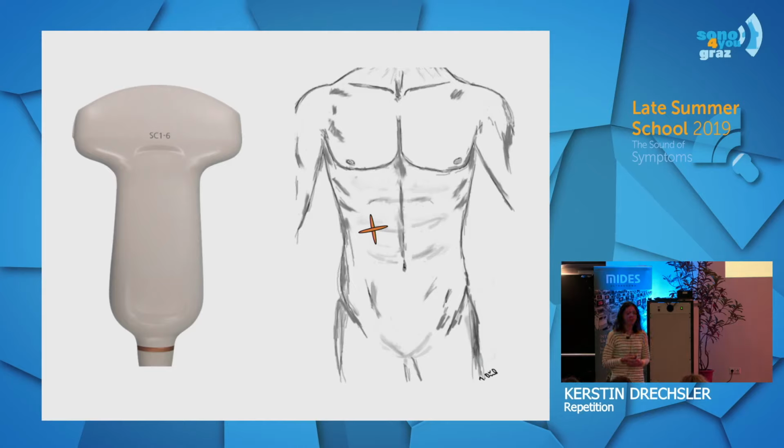So what are my take-home messages in that case? If a patient complains about biliary symptoms, he has right upper quadrant pain, a pathology of the gallbladder is likely, and you might want to take the abdominal array or the curvilinear array and place it in the mid-clavicular line, intercostally or subcostally.